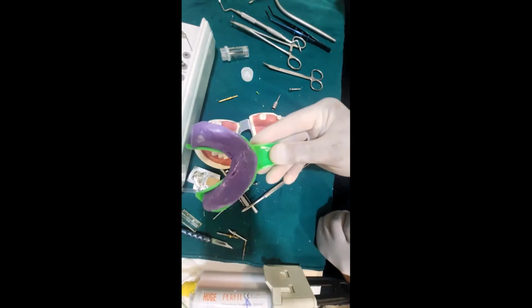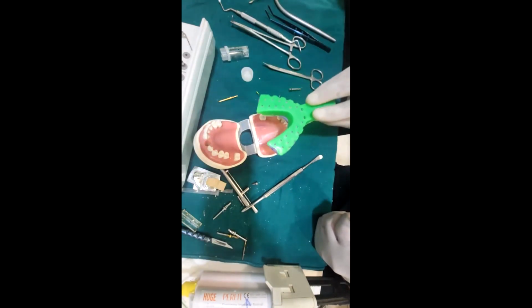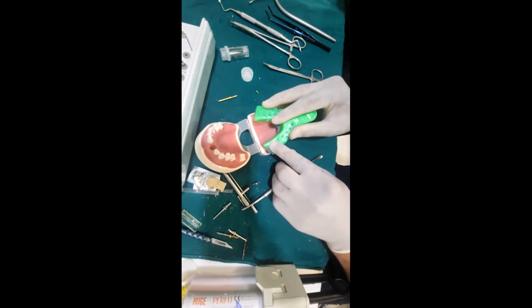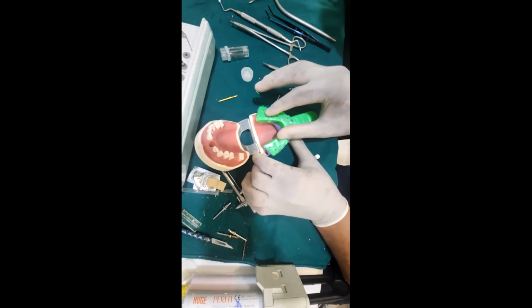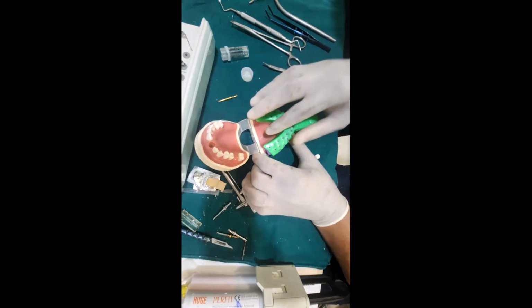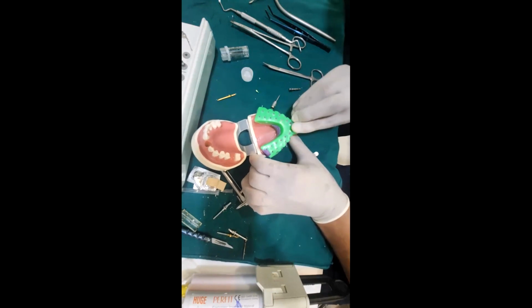So I have the heavy body loaded on my impression tray. We just gently place it over here. Wait for about 5 to 10 seconds, not more. Ask the patient to do the tongue movements and all if you want to.